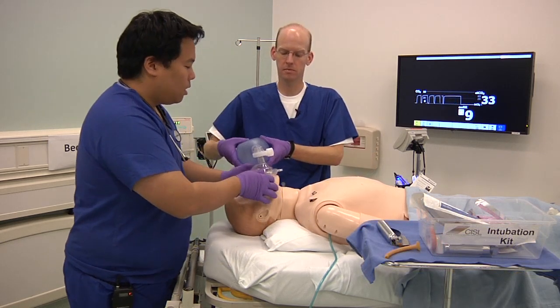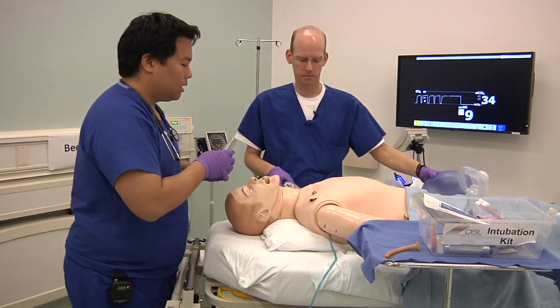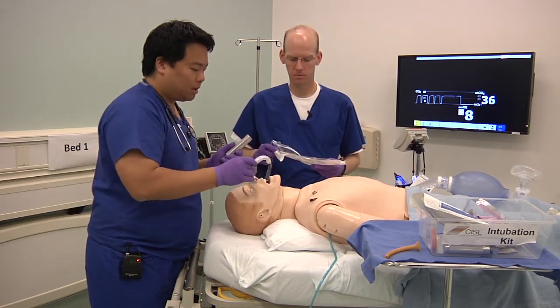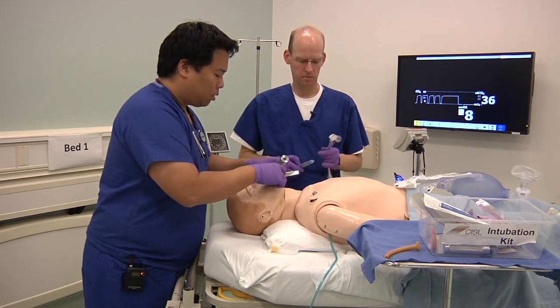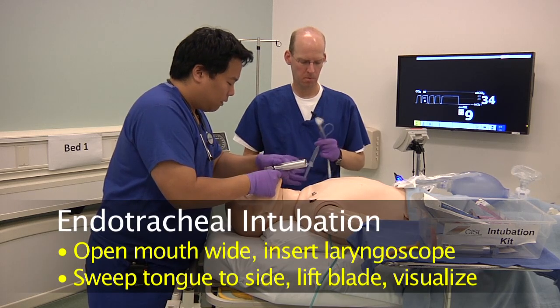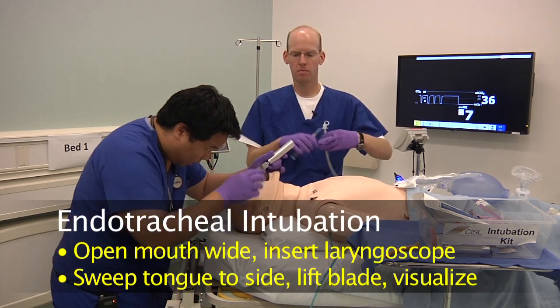Okay, so now when you're ready, you can perform endotracheal intubation. As I mentioned, the height of the bed facilitates this. We're not going to go into all the steps of it today. That's really beyond the scope of this tutorial. The key, though, is to really open the mouth widely, start from the side, and then sweep the tongue out of the way. Tell people what you're seeing.